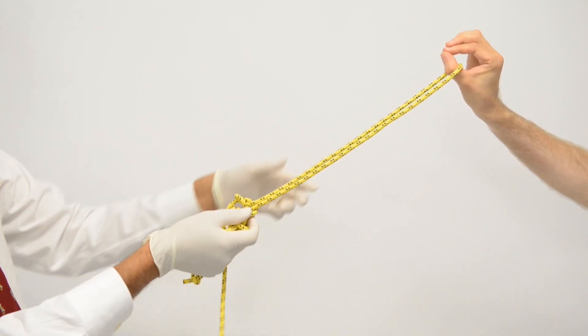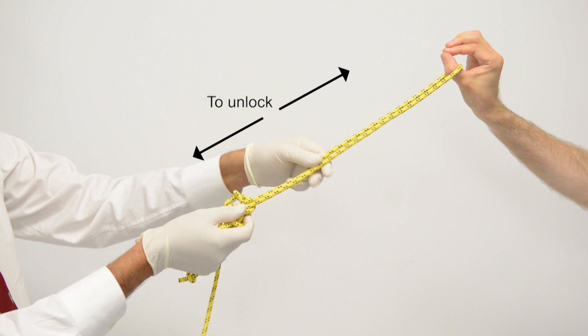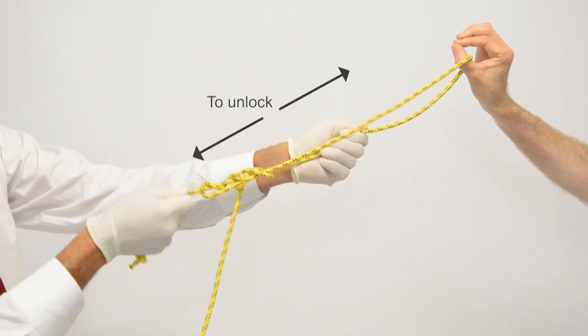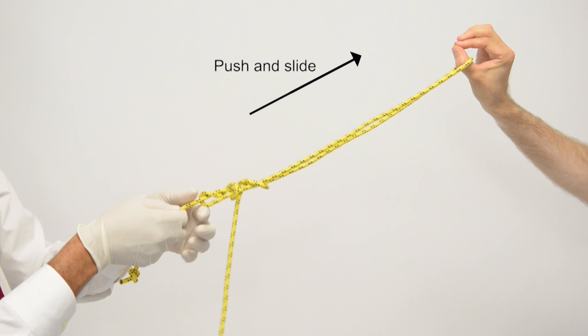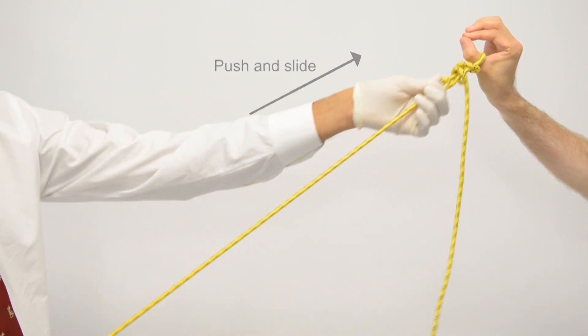To unlock the knot, leave the tail end of the rope and pull in the opposite direction on either side of the knot, holding the left arm of the knot and the needle end of the rope.